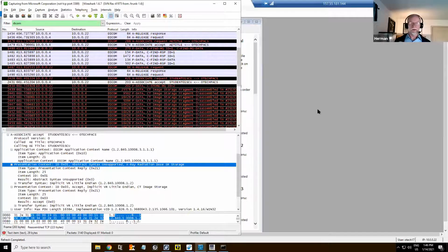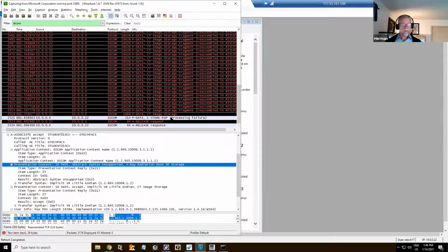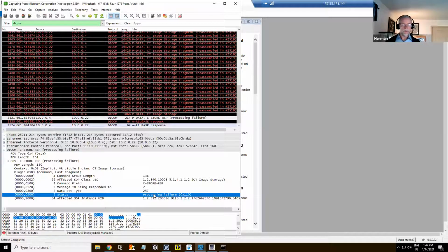That's the first error. The second potential error would be right here, right? Remember, all the way at the end, the C-STORE response. And in my C-STORE response, I got a processing failure. What does that mean? The PACS says, okay, I have a problem. Even although you sent my C-STORE, and the whole information went back, I didn't process it correctly.